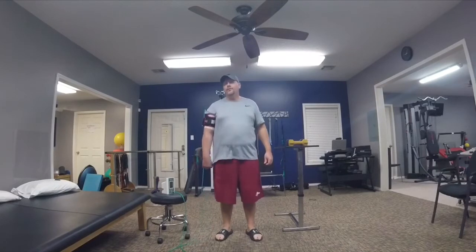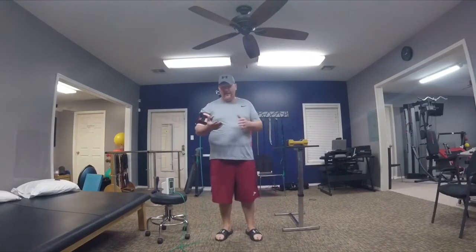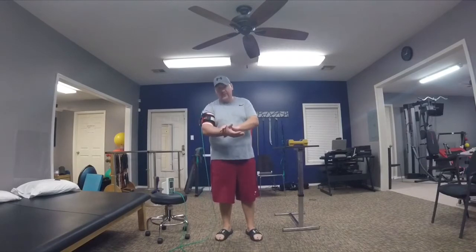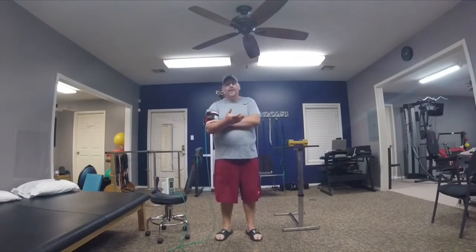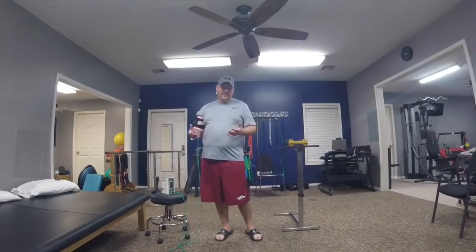Now the protocol for BFR is 30 repetitions to get that oxygen out of the arm, and then you do 3 sets of 15 after that. Each set you're going to rest about 30 seconds in between.